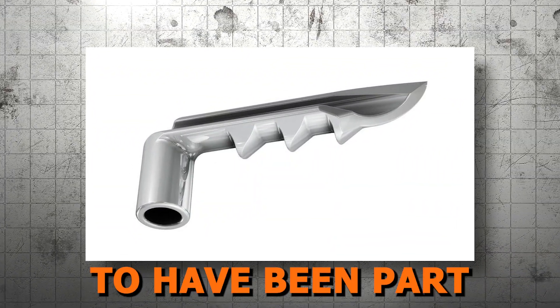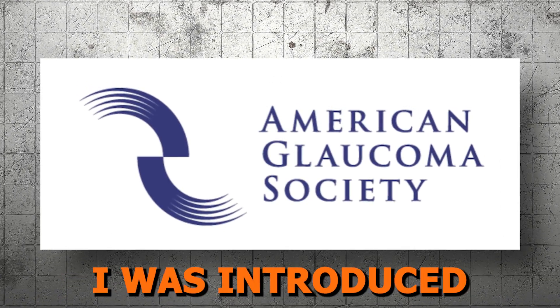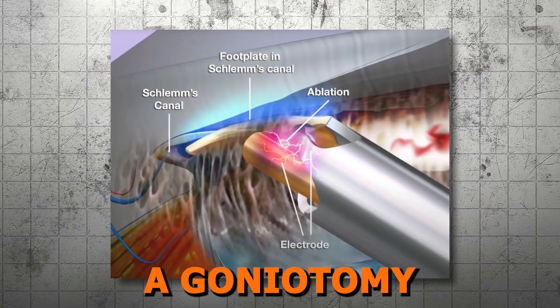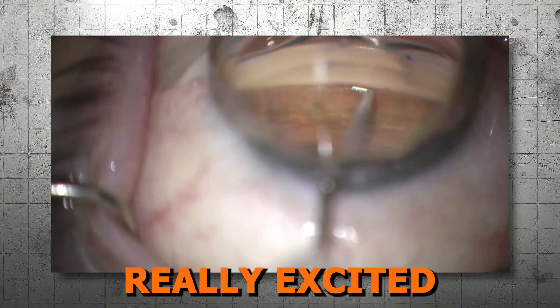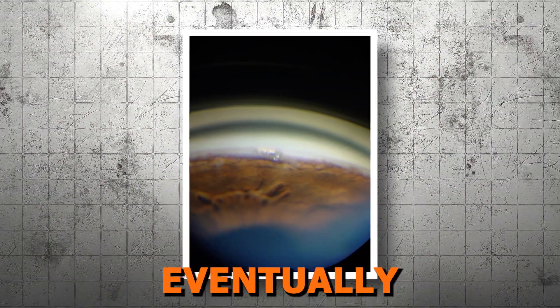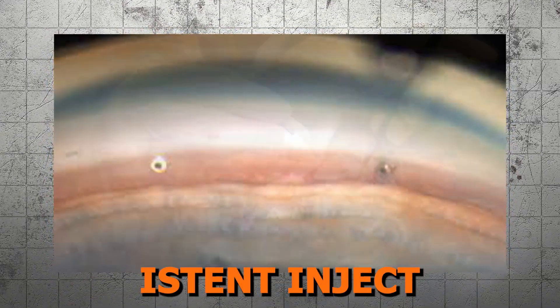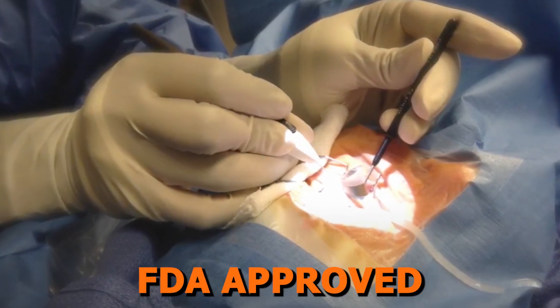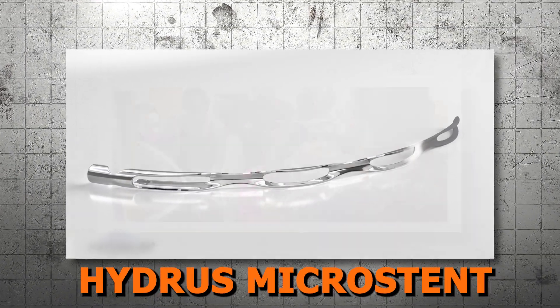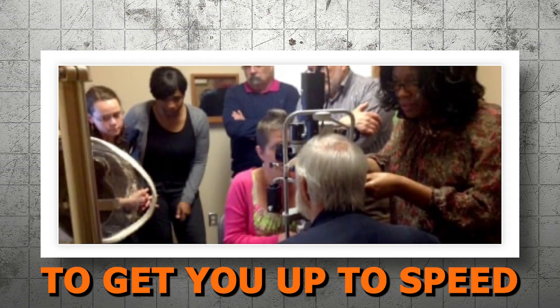As an early MIGS adopter, I feel privileged to have been part of the evolution of the trabecular bypass stent devices. I clearly remember the first day I was introduced to the iStent device at an American Glaucoma Society meeting. I had already adopted the trabecular ab-interno procedure, and I was really excited to add a new device with a different mechanism of action to my armamentarium. My intrigue eventually turned into being invited to be a clinical trial investigator for what is now iStent Inject, and I was one of the first in the country to put the FDA-approved iStent Inject device in my glaucoma patients. I was just as eager to onboard the Hydrus Microstent and have helped to train surgeons on all the bypass stents.